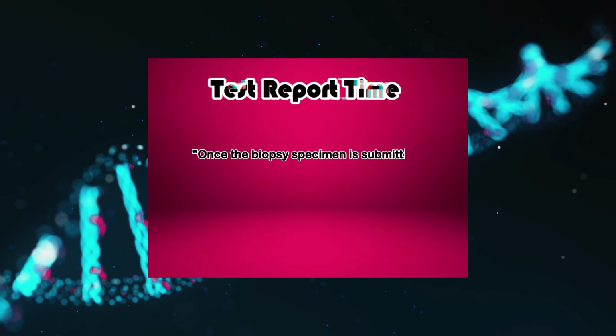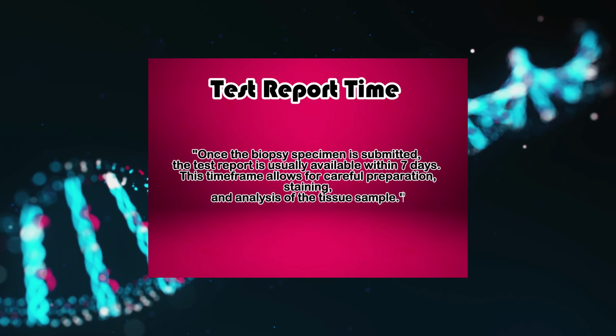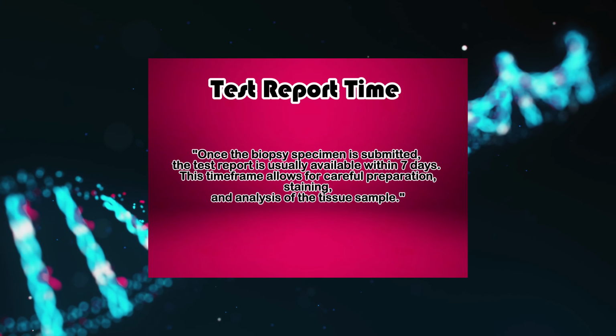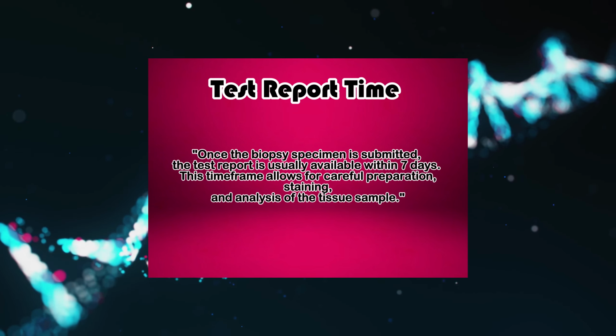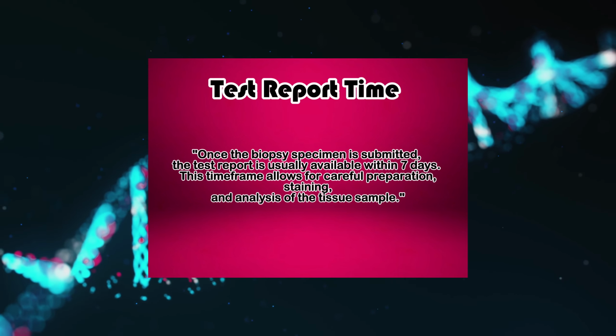Test report time. Once the biopsy specimen is submitted, the test report is usually available within 7 days. This time frame allows for careful preparation, staining, and analysis of the tissue sample.